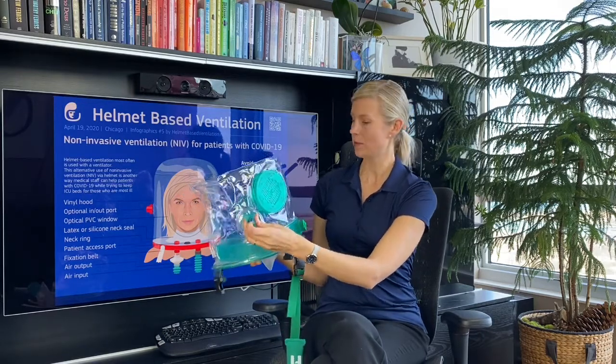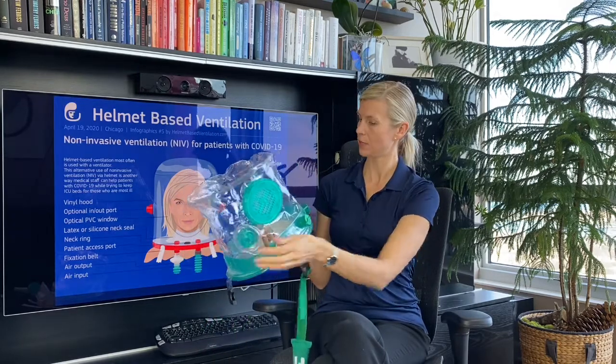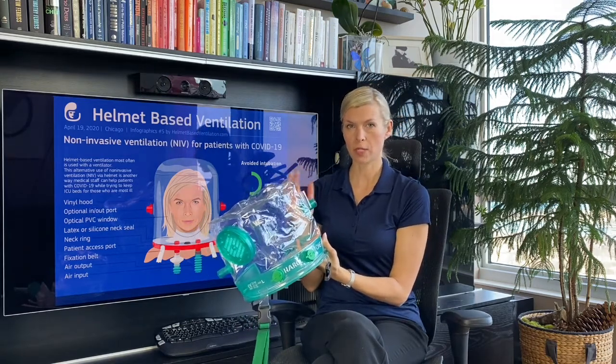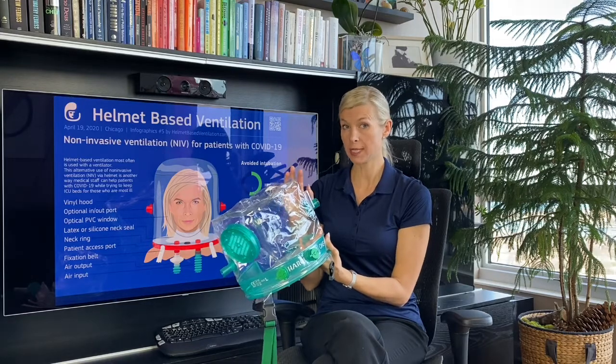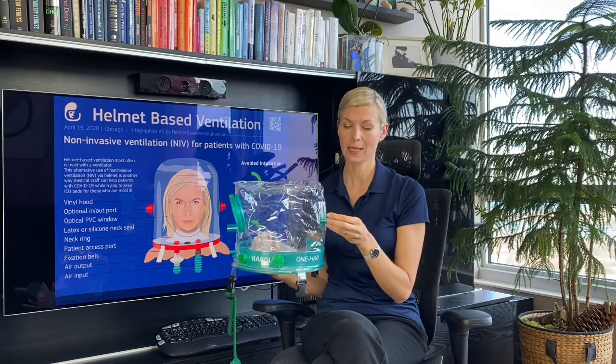The inlet and outlet ports are on the hood part, and what is nice is that on the outlet side you have a built-in manometer. The manometer is very important to measure actual pressures inside the helmet, especially during helmet CPAP therapy. Studies showed that the pressure can actually be higher in a helmet than what is set on a PEEP valve, especially spring-loaded PEEP valves. By having this manometer on the helmet you can prevent too-high pressures and provide adequate ventilation for the patient.